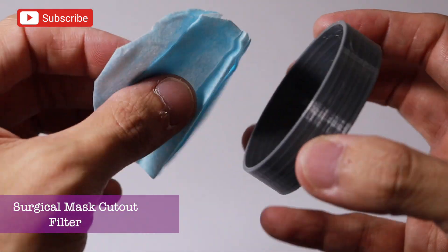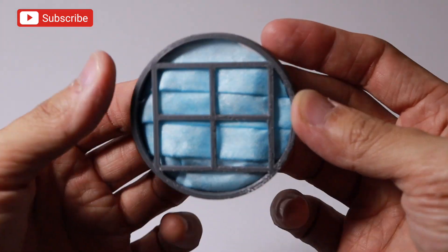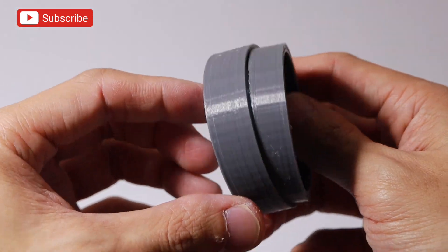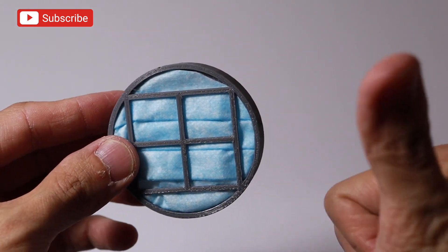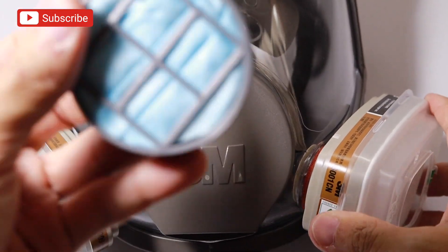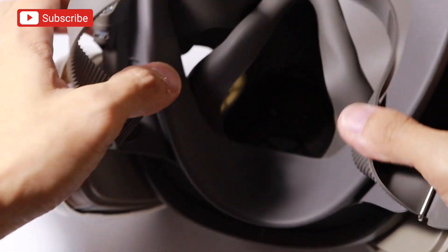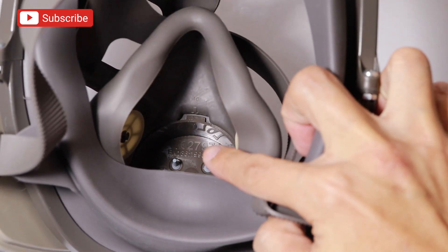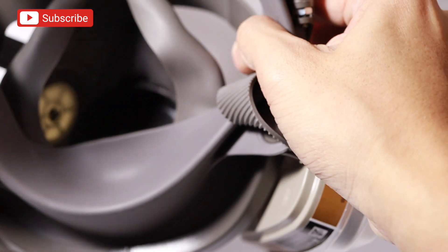Very important is to have a filter — surgical mask cutout yung ginamit ko dito. Yung white part should be facing inside and the blue part of the mask should be facing outside of the filter. Make sure na yung smaller part ng filter is secured para hindi matanggal yung filter. This part is for the installation of the exhaust valve to the 6800 full-face respirator — sa loob natin siya ilalagay. Make sure natin na snug fit siya doon so that hindi siya maging wobbly kapag sinuot natin siya.